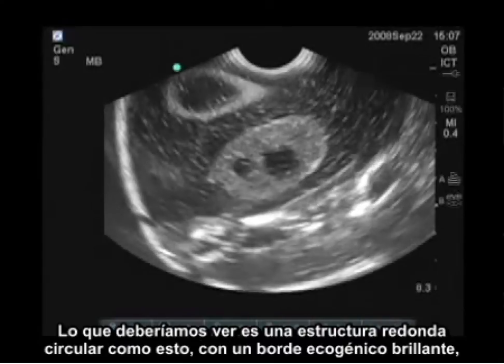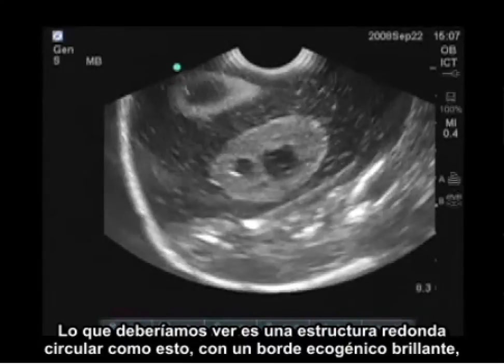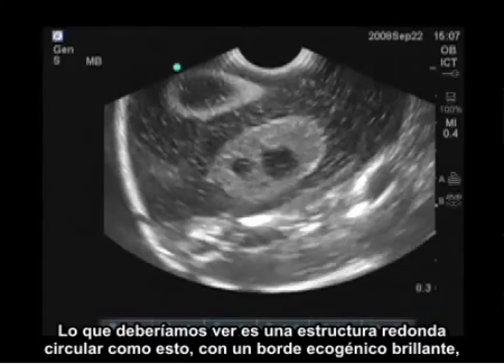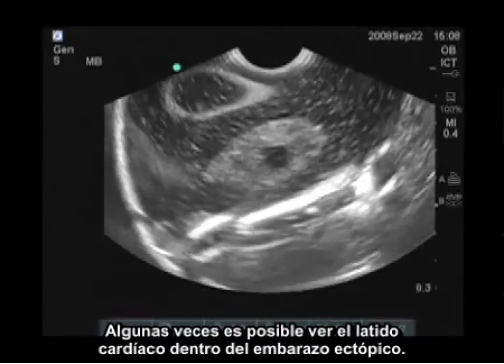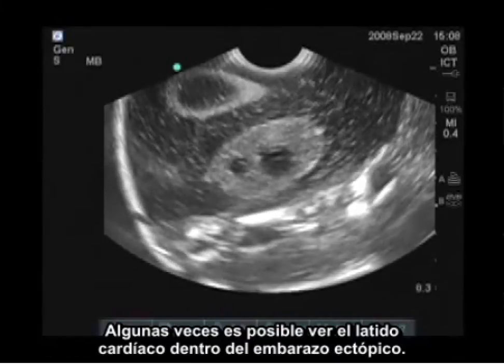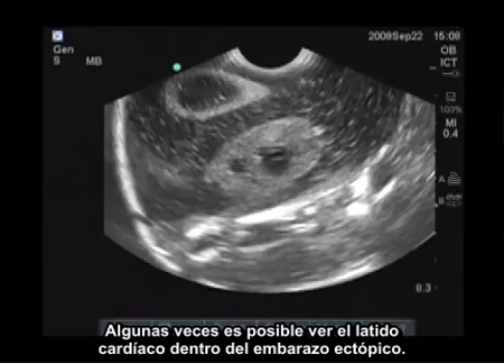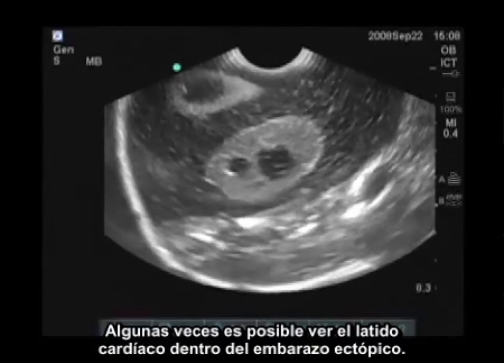And this is what you should see — a round circular structure with a bright echogenic brim. It is also possible to sometimes see a fetal heartbeat inside the ectopic pregnancy.